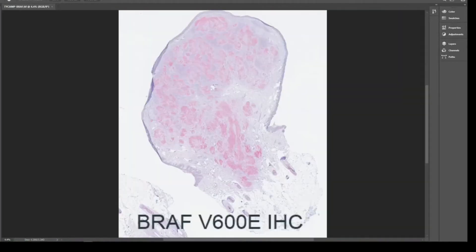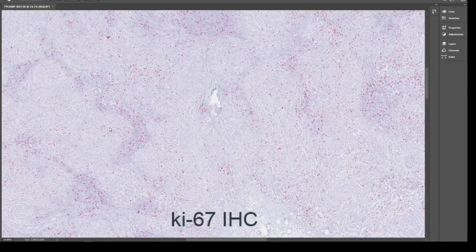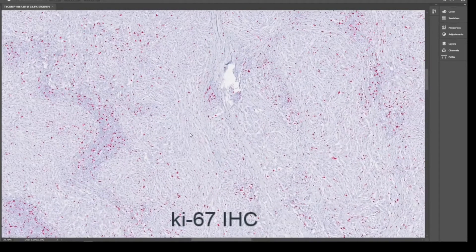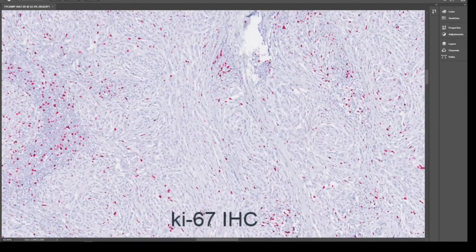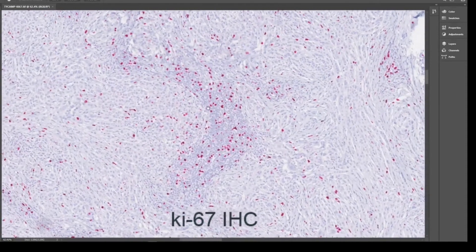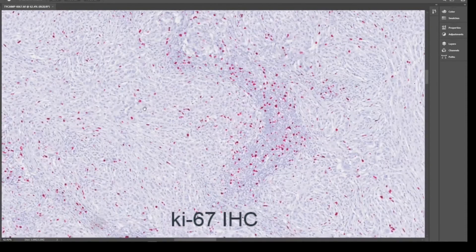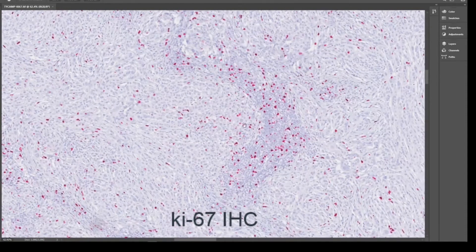In this case, the BRAF V600E IHC was positive throughout all the melanocytes. The Ki67 proliferation index was very low within the clonal melanocytes with less than 10 percent of positive nuclei, whereas a high number of lymphocytes were positive.